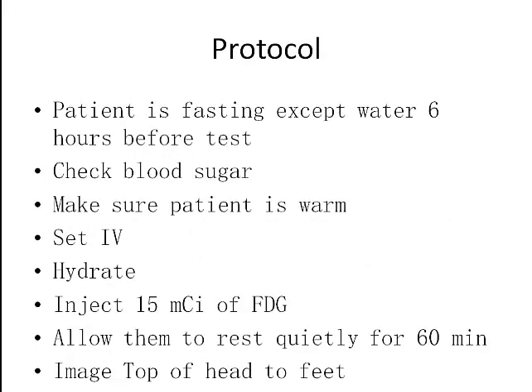So, protocol. I know we're dose heavy on this. I do expect us to go down, but the patient is fasting except for water. You do have to be careful in this patient population. A lot of these patients have IV drugs hanging with D5 or D50 or some sort of glucose material. A lot of these patients are on TPN. A lot of these patients they're trying to get calories into. These are very ill, sick patients. So you have to be very careful in your screening process.